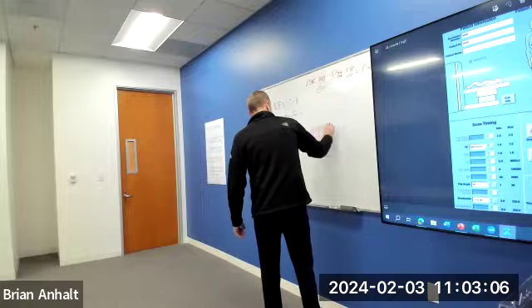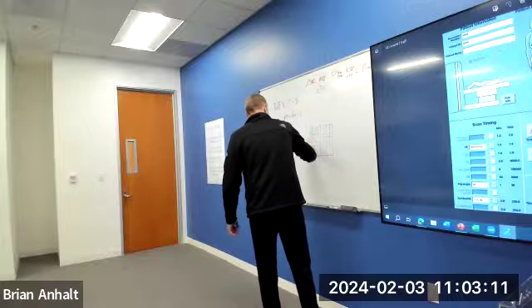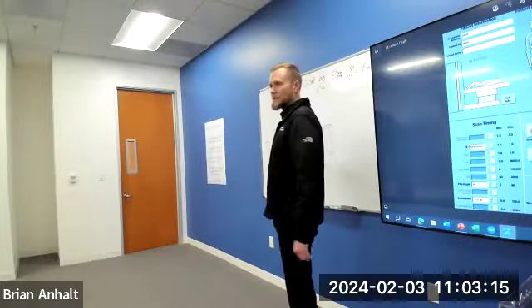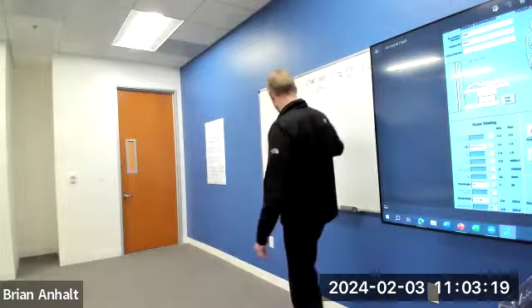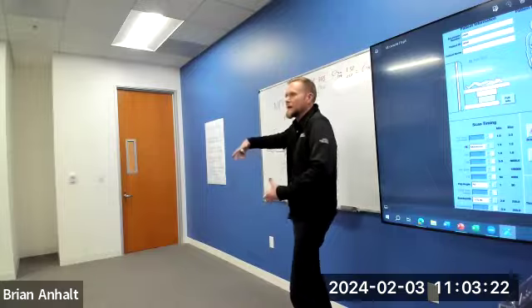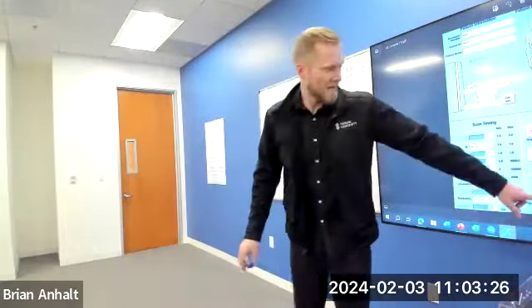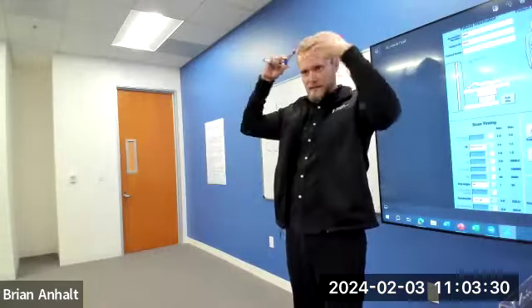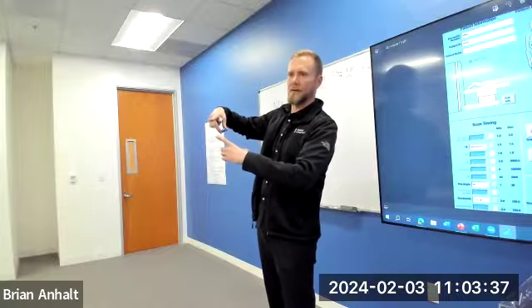And we're going to slice it like this. Right? And that is going to give us the size of the pizza pieces. Our field of view is how big the entire pizza is. In this case, it's 24 centimeters. That's a good sagittal of the head. That's a good size for sagittal. 24 centimeters is probably about that.